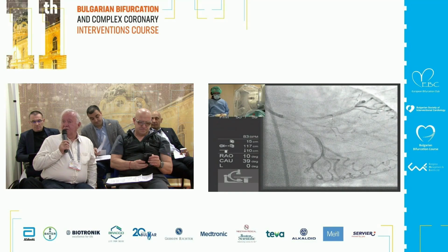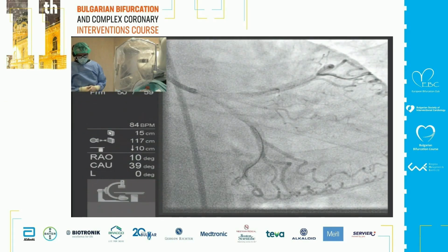And then I've seen this placed in such kind of scenario that if you don't have the right radial, you cannot push the device. I was really amazed that you can puncture the radial a few centimeters higher with echo guidance. And then you can recanalize it, as you said. I mean, you can do things to restore the patency, and it might work sometimes.